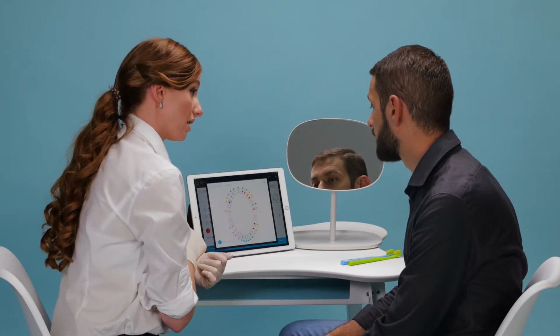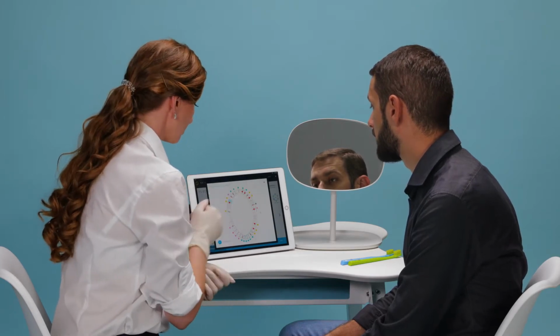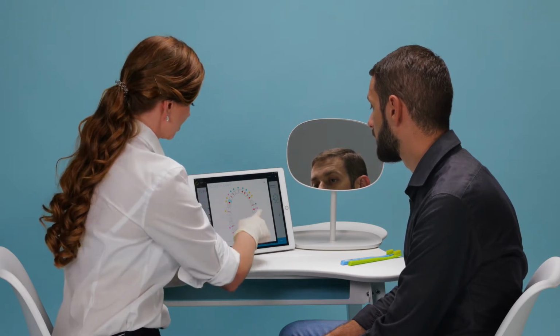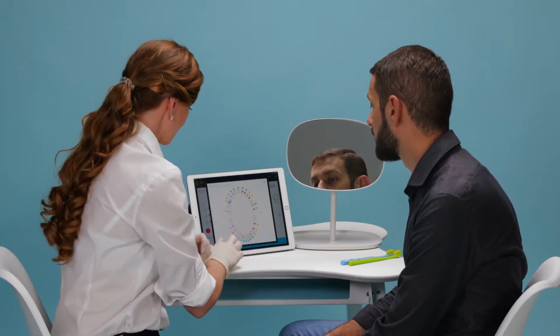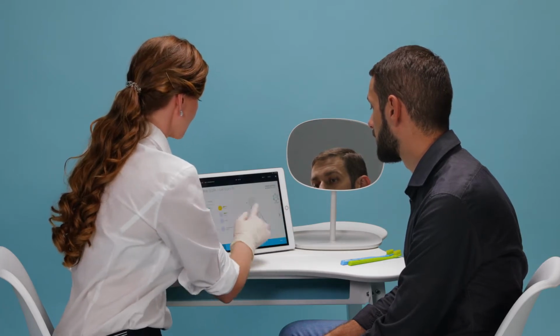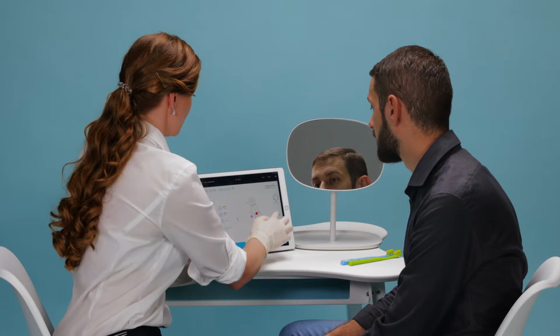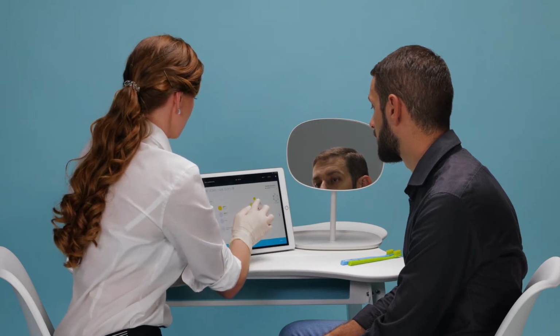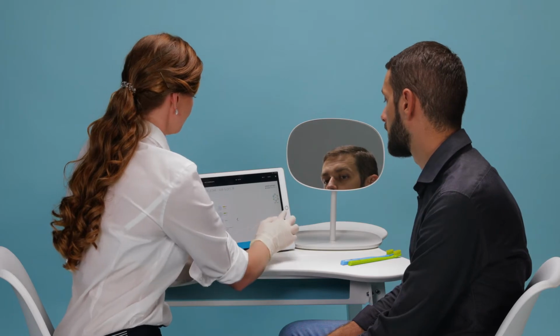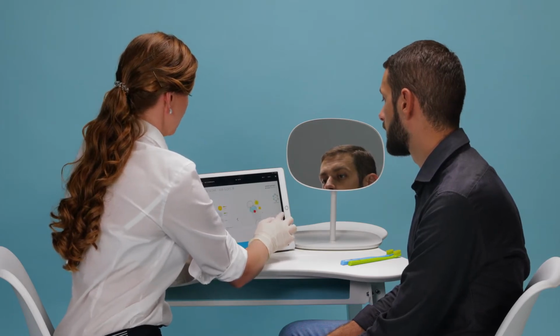At this point, I can review how many interdental aids I have input and reduce the quantity if necessary and appropriate. As there are 4 interdental aids on this current chart, I have decided with the patient to reduce it to 3 today. At this point, I am then able to return to the chart and change any interdental aids necessary. In this case, I changed the yellow interdental brush to that of the pink.